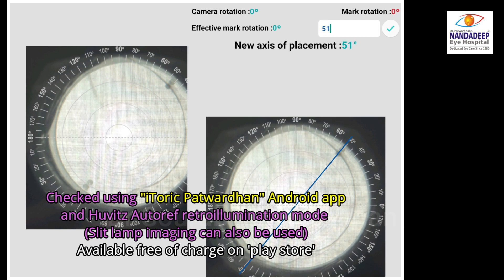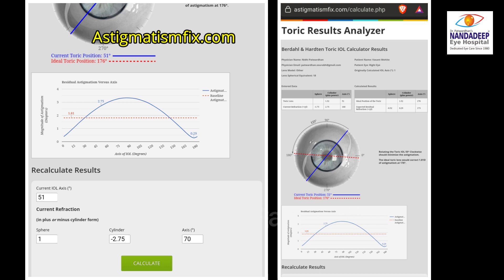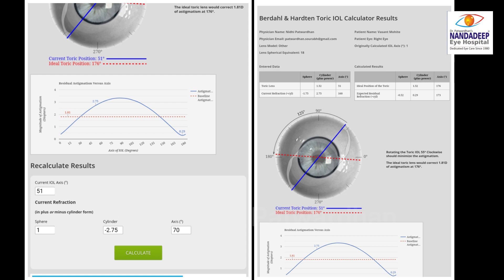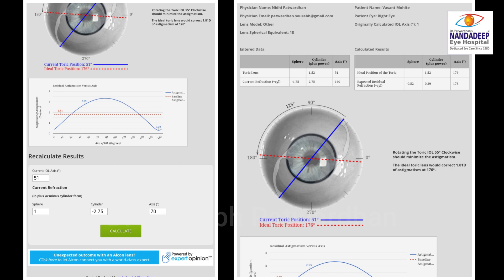These values are then entered on astigmatismfix.com. I entered 51 degrees as the current IOL axis along with the post-operative refraction. It's important to note that unless the spherical equivalent is close to zero, the problem cannot be fixed by rotation alone. The website's algorithm calculates the ideal IOL position — here it shows 176 degrees, which is close to the pre-operatively determined axis of 1 degree.